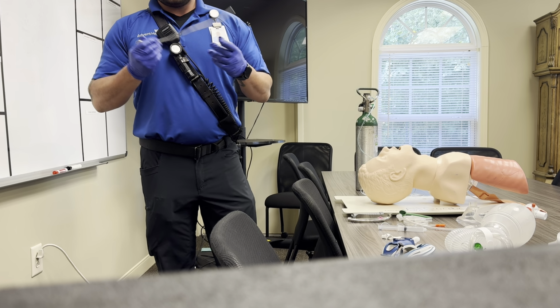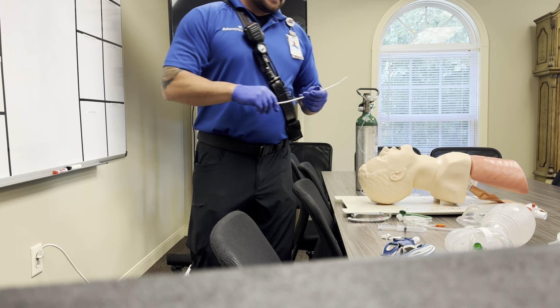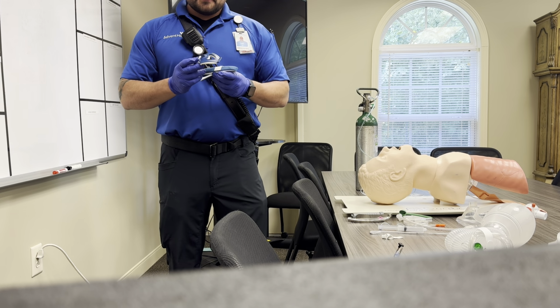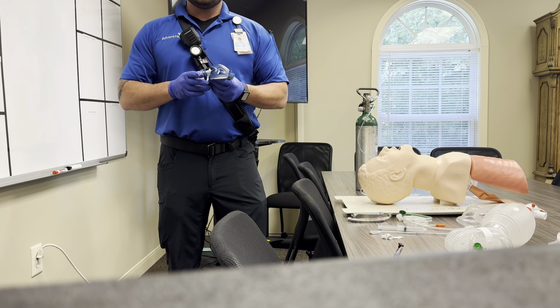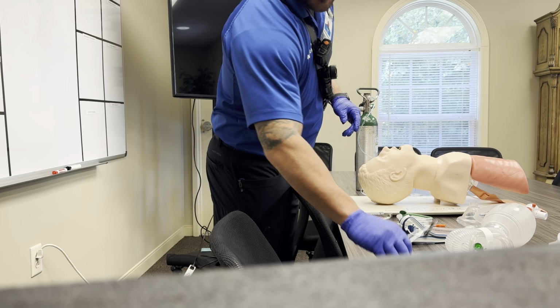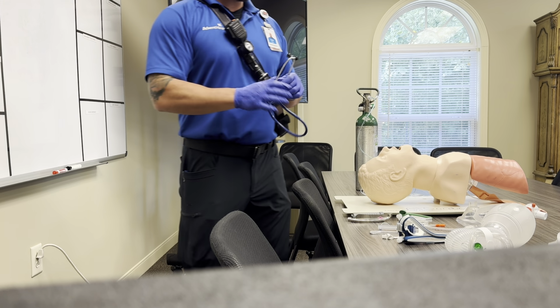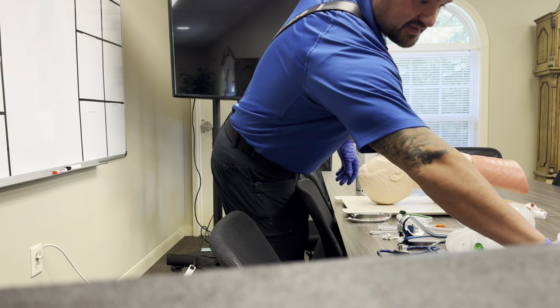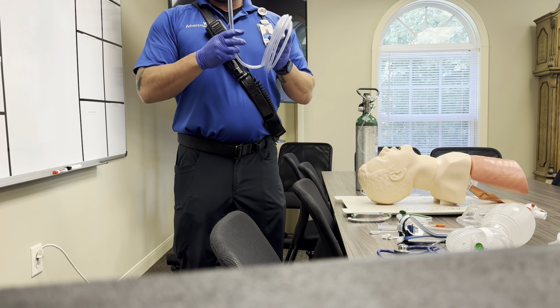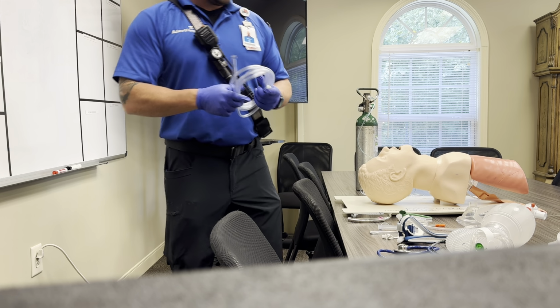A stylet, we use the satin slips or a bougie device. So we have a satin slip stylet today. Commercial tube holder, we use the Thomas brand. Some services, I can't really name any to be honest, use any different ones, but I'm sure they're out there. We always want to make sure we have a stethoscope, so we can also take for our lung sounds, breath sounds. Appropriate suction, and obviously a suction device. Particularly we use Yankauer suction catheters, like them, think they're the best.